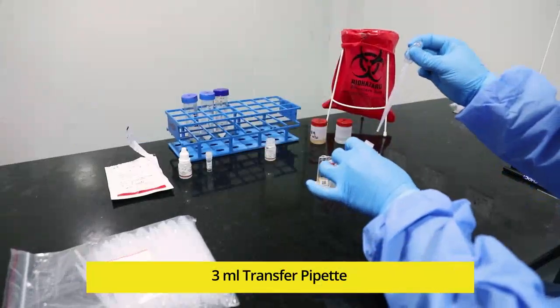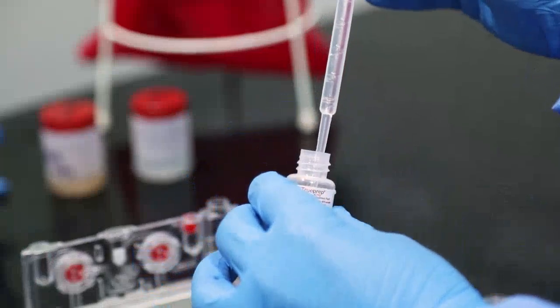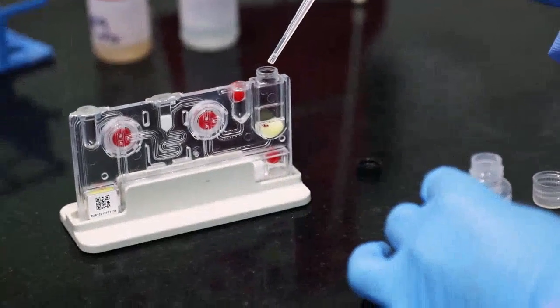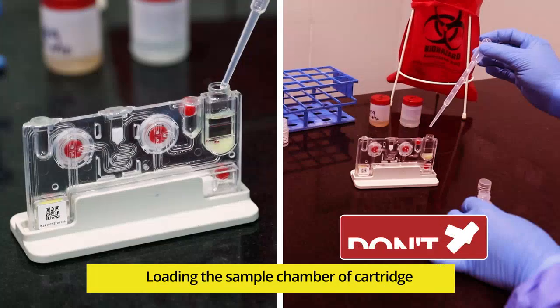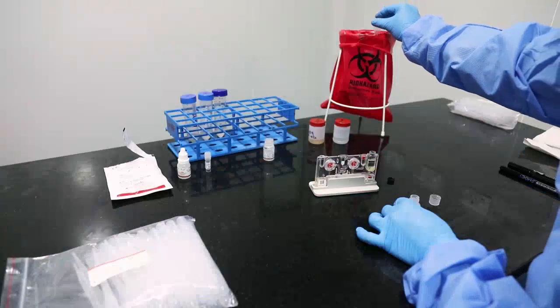Press the bulb of the transfer pipette. Immerse the pipette into the Lysis buffer bottle and release the bulb slowly to aspirate completely. Immerse the pipette inside the sample chamber of the cartridge and transfer the contents slowly. Do not drop the contents of the pipette from a height. Discard the transfer pipette.